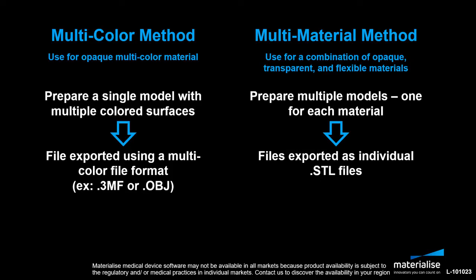The multi-material method is applicable when using a combination of opaque, transparent, and/or flexible materials. In this method we will prepare a model file for each material that will be used in the final model. These files can be exported individually as STL files and the specific materials will be assigned during the build preparation step.